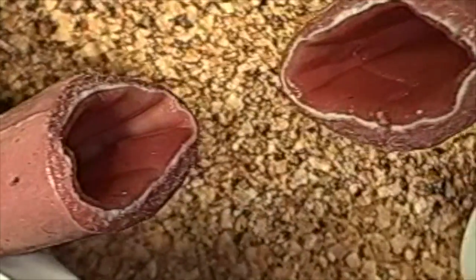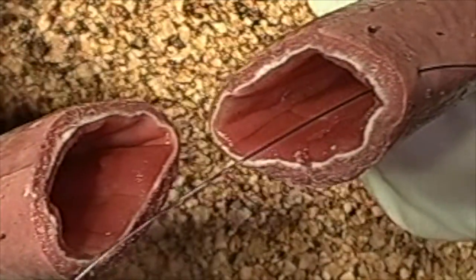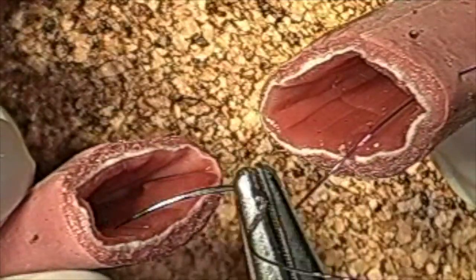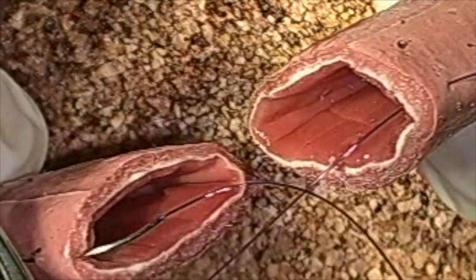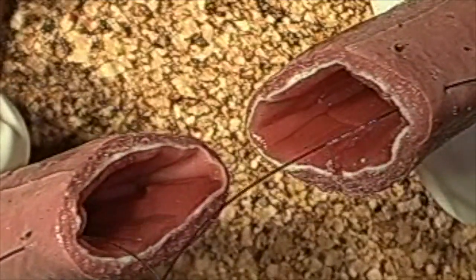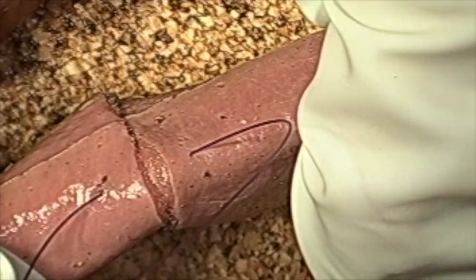As you can see here, we're trying to put the ends together. We're going to pretend one of these is a mesenteric surface and one is an anti-mesenteric surface. Let's assume we're doing the mesenteric surface. We typically do one that is almost at that 12 o'clock mark, and we're going to go ahead and do that modified Gamby bite, then see how it opposes together to check the continuity of the bowel.